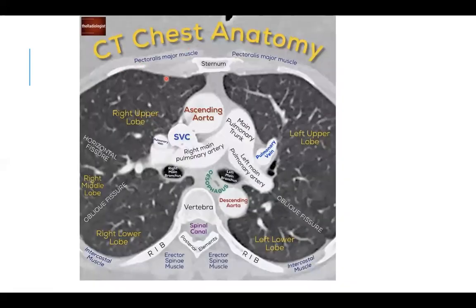I think what's really important though about CT thorax or CT chest imaging is that you need to really be familiar with what's normal and have a good understanding of the anatomy. And there are really good resources for this. I think Radiopaedia is one. Just have a look at all the normal images, and then you'll be able to detect what's abnormal.